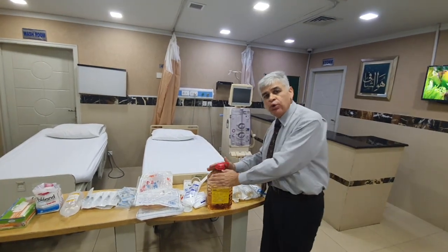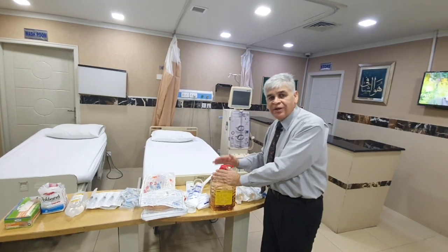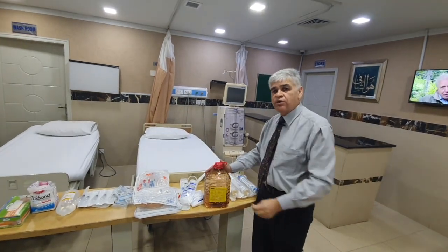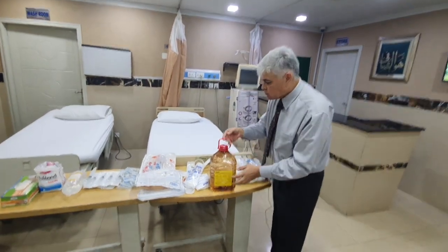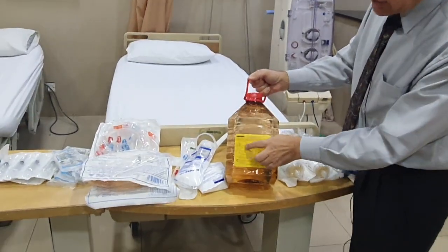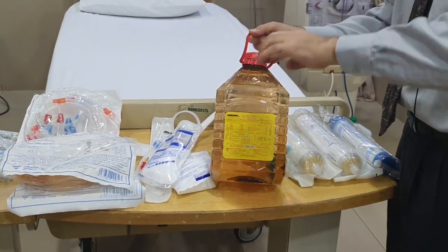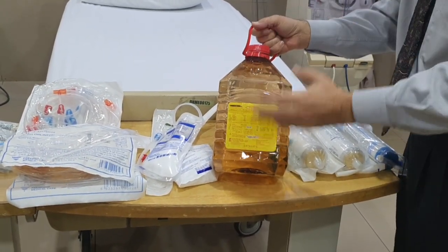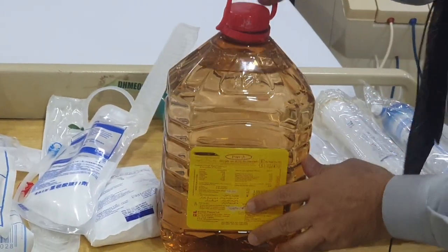So you can never get a zero sugar bath. You can never get a zero potassium bath, because then obviously that will be detrimental. And this mixes with this. So always read the label, always read what it says here and how much concentration is going in. It has to be planned, it has to be designed. Every dialysis session is designed. It's a custom-made dialysis session. It's not like one session fits all.